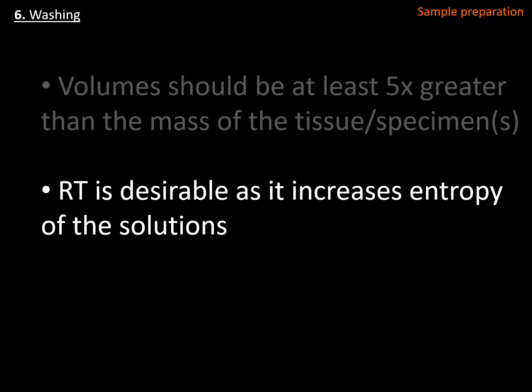And by increasing these washing conditions, antibodies that are not tightly bound, like the ones that are not bound to your target, will get released from the tissue more easily and allow you to have a much cleaner sample.